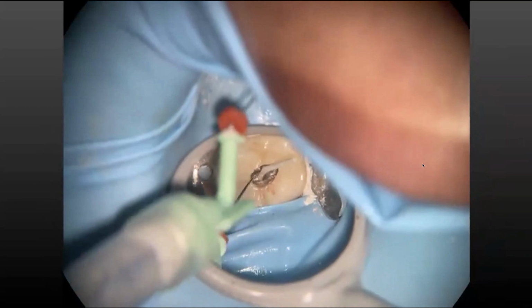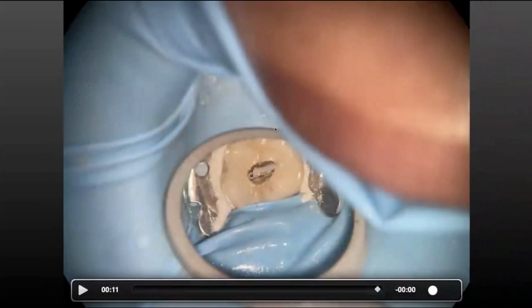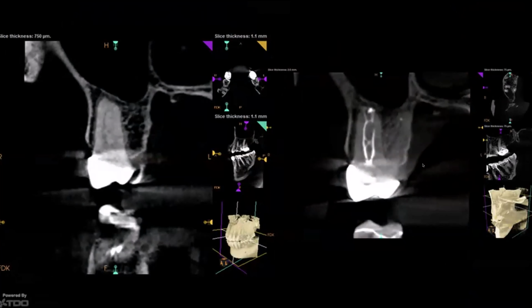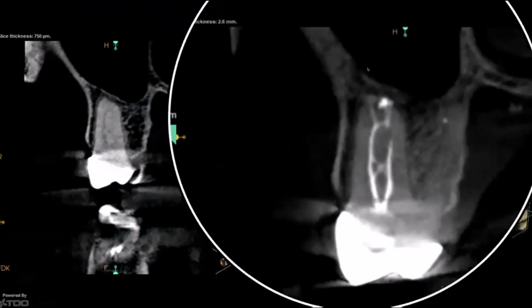I inject. So now the sealer is getting pulled into the confluent canal, and then I'm going to remove that paper point and then inject with the Obtura in that second canal. You got 2 to 1, then a redivision, and then a resplit in the apical third.